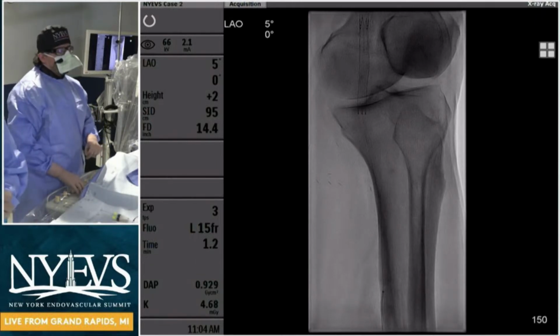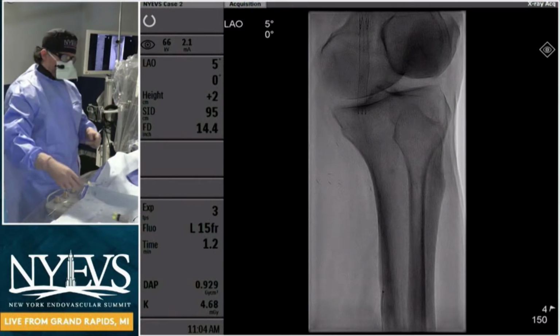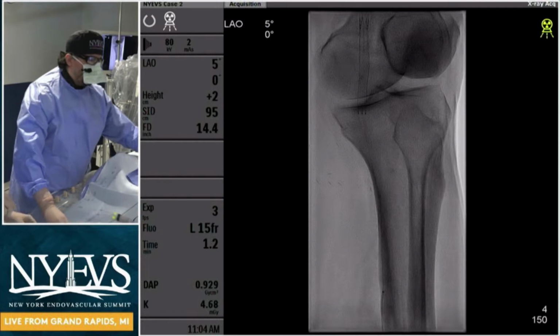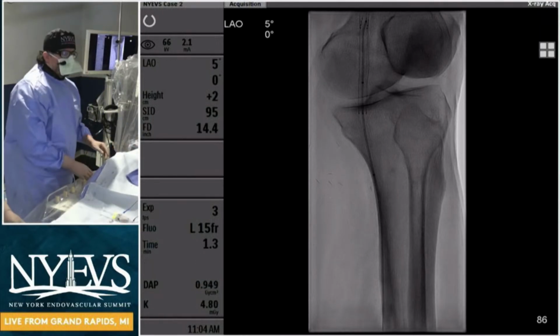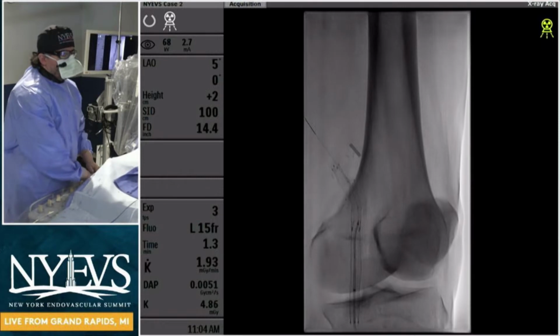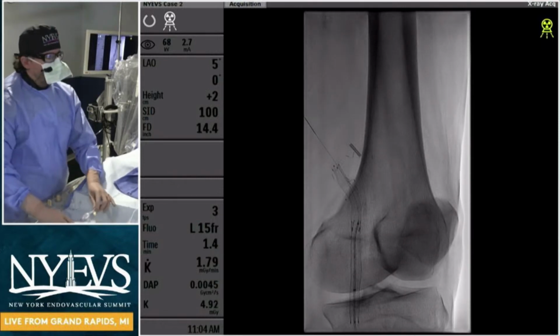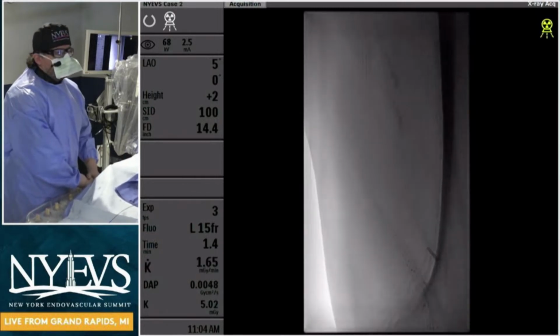But I want to point out that even with selective angiography, with the tip of the catheter next to what I think is a lesion, I was not able to opacify it. So I'm going to advance my Navicross catheter here into what appears to be a stented portion of a bypass. And we're going to take the wire up. Can I have the freedom flow wire, please?